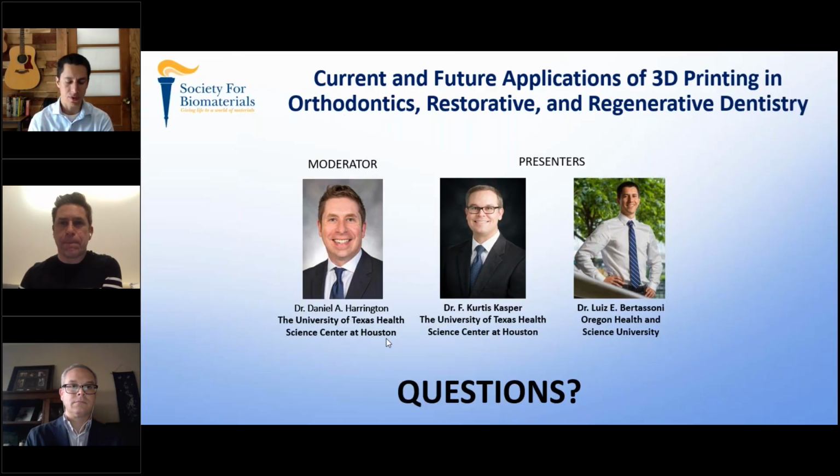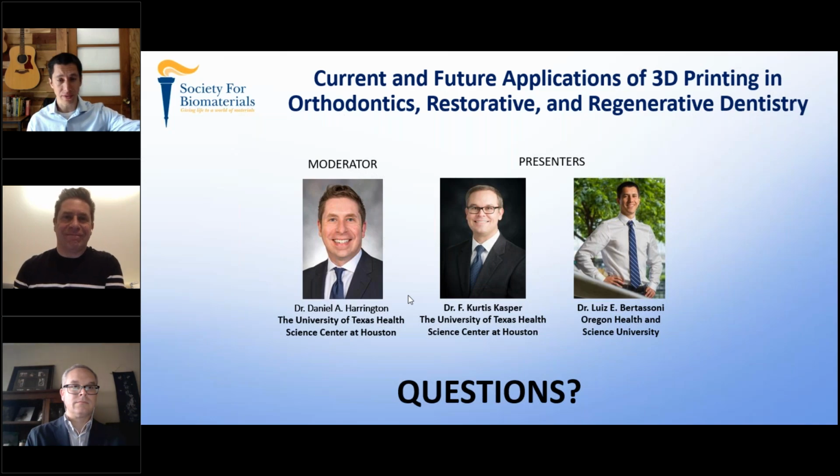Yeah, the viscosity is the major roadblock, right? If the viscosity is too high, especially for these light-based processes, you basically can't really print. So in that case, you have to be within a very low range of viscosity to enable that type of light-based lithography printing. And I think it's relevant to say that Lithoz specifically found a very specific composition that works really well to allow you to reach very high density after the sintering process while still maintaining the viscosity very low to enable the printing process.